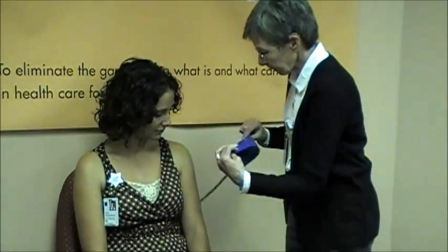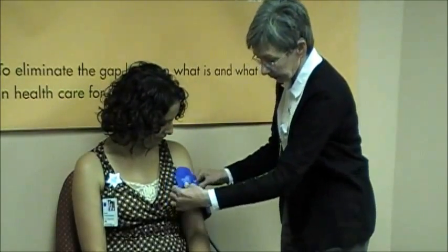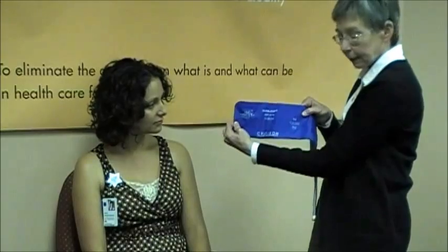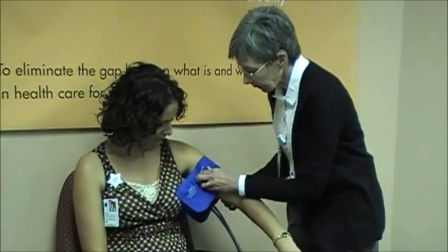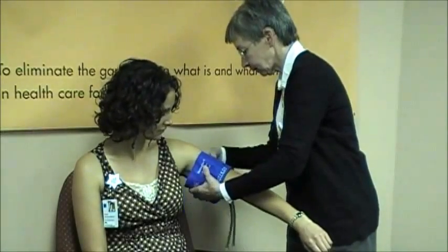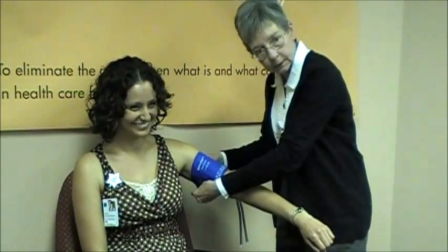The other way to visually judge the sizing of your cuff is to compare the bladder length — the long part of the bladder — to the arm circumference. In this case, it should cover 80 to 100 percent. And again, a small adult cuff does not.